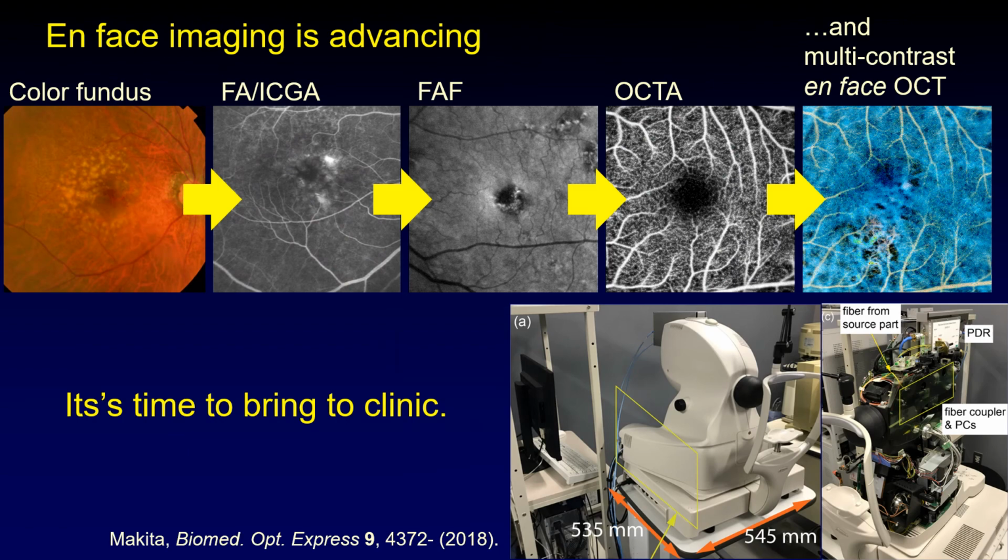So, let me conclude my talk. Here we demonstrated totally motion-free wide field and multi-contrast OCT. It can be used as the fifth generation of the en-face retinal imaging modality, and it will hopefully soon be translated to the clinic. Thank you for your attention.